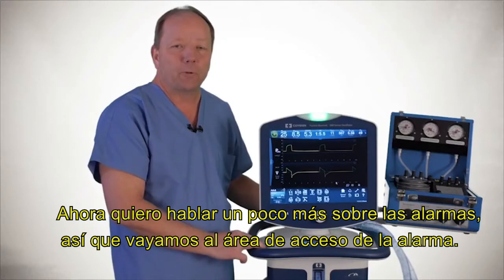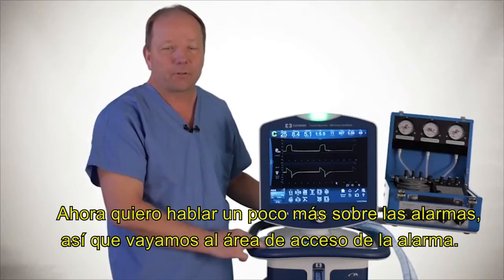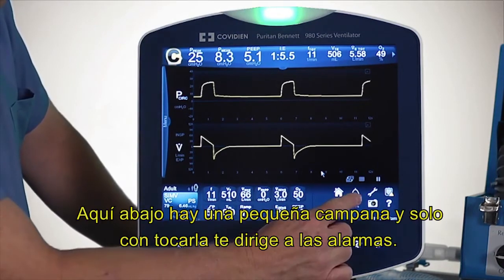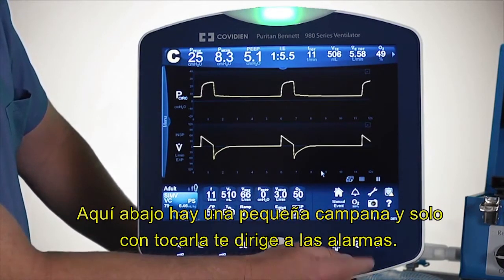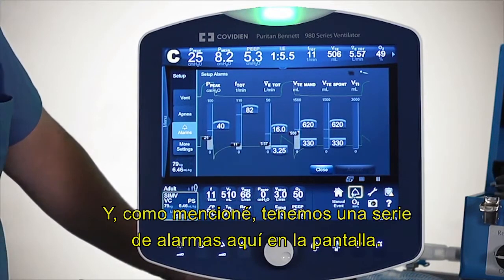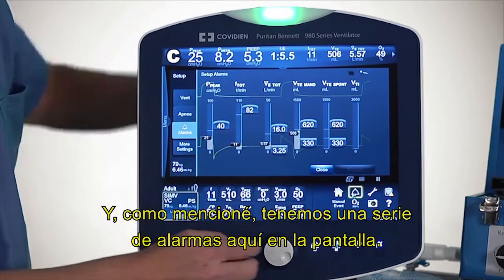At this point I want to talk a little bit more about the alarms. So let's go to the alarm access area. Right down here there's a little bell, and I'm just going to touch that little bell, and that brings up the alarms. And as I mentioned, we have a number of alarms on the screen here.